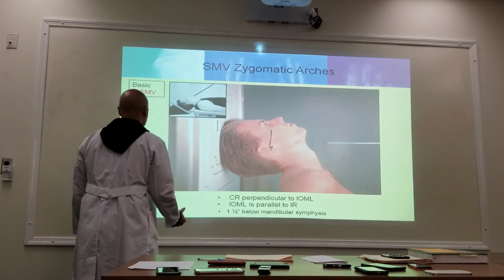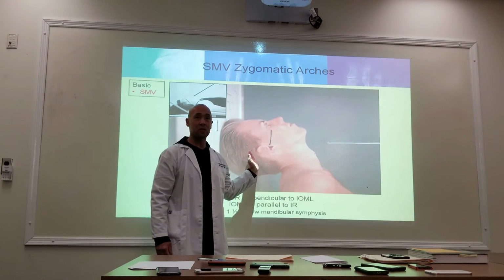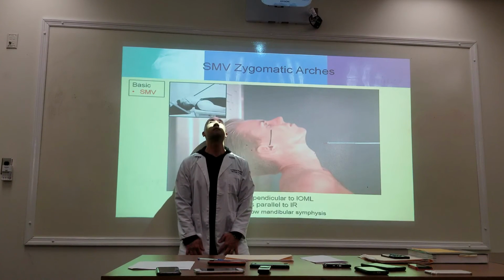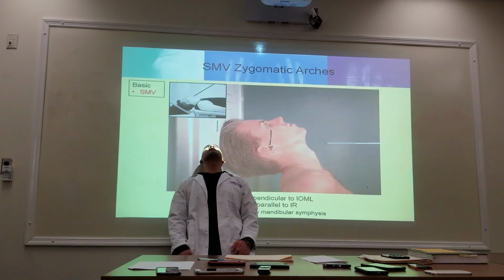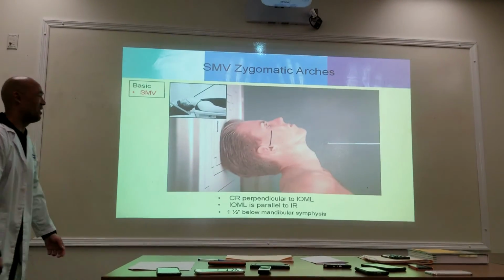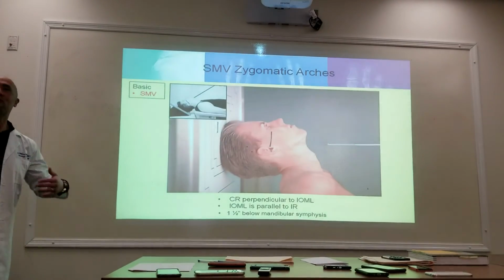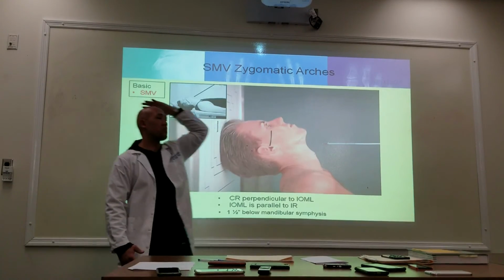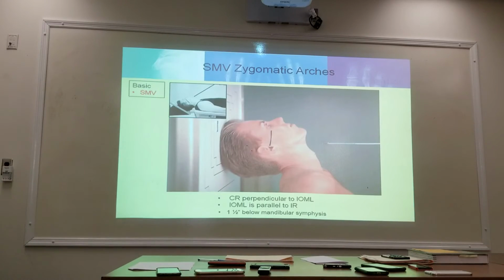The trick here is the further that your back is away from the image receptor, it is a lot easier to do this than if you were closer to the image receptor. Now you're really having to slide forward, so it's a lot easier to put it up on the board. Does that make sense? So the further that the bottom is away from the board, it's a lot easier to get them to the top. But the closer they are, it's harder to reach that position. Okay, upright.